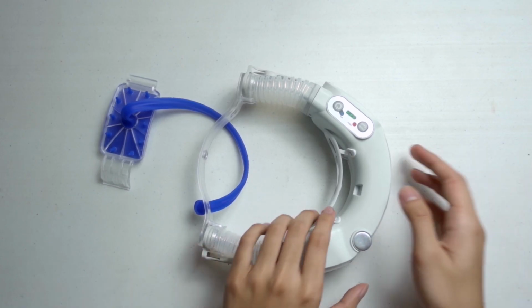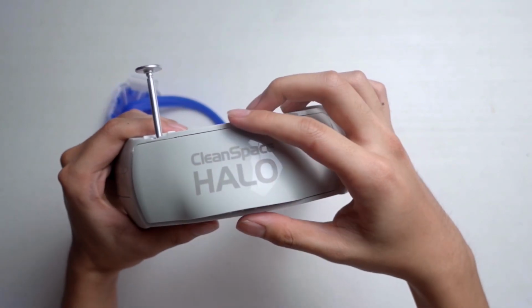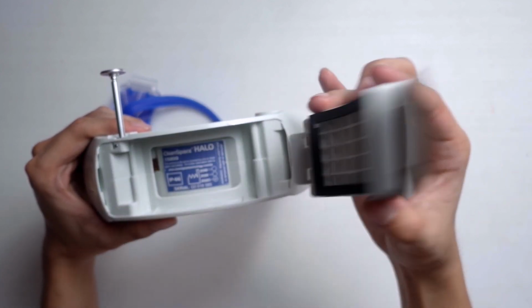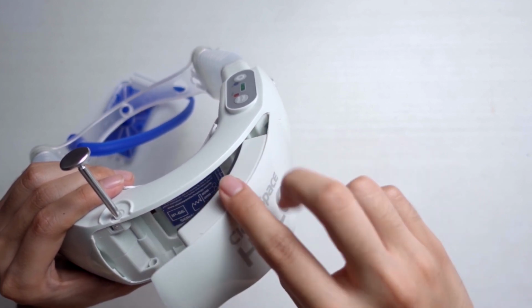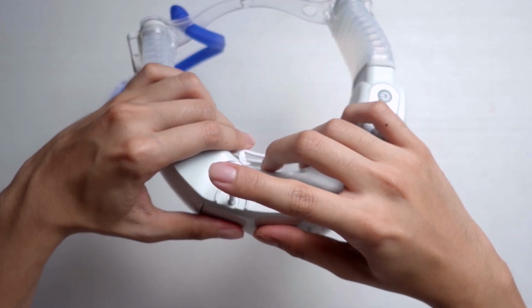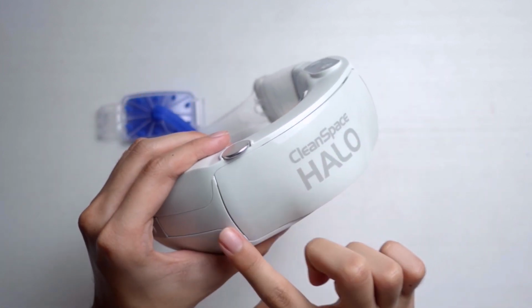Now removing or replacing the filter is relatively straightforward. All you have to do is pull up the pin on the left side and then remove the old filter. If you want to fit a new filter, all you have to do is insert the right side first, making sure that the CleanSpace logo is right side up. And once you do that, you have to press the filter firmly onto the respirator and lock the pin back in place. Check that the filter is secure and that there are no gaping holes.